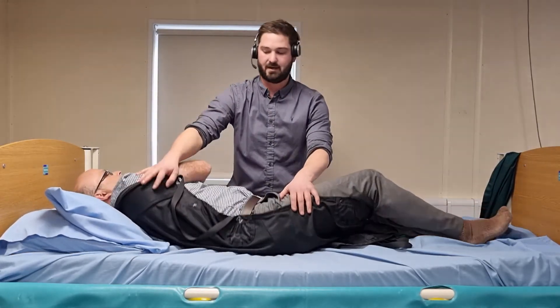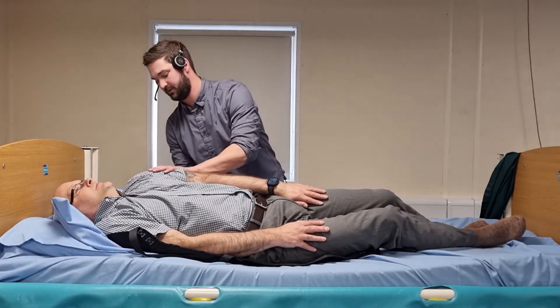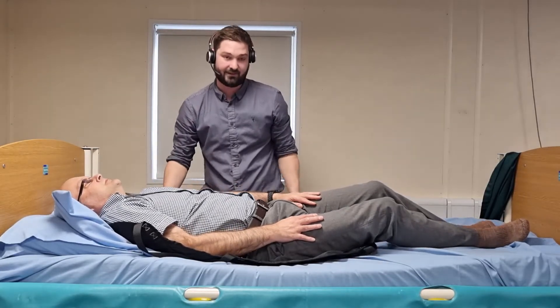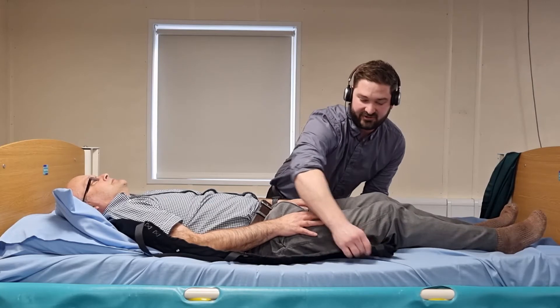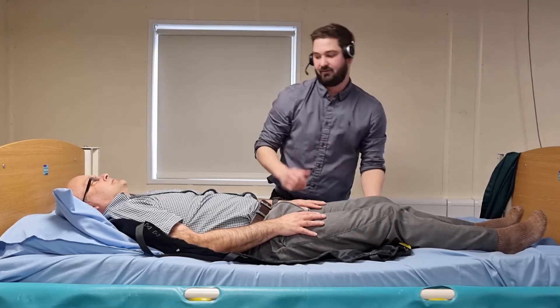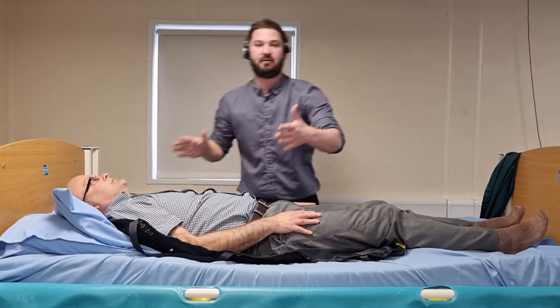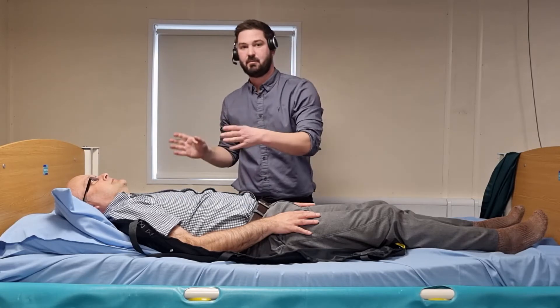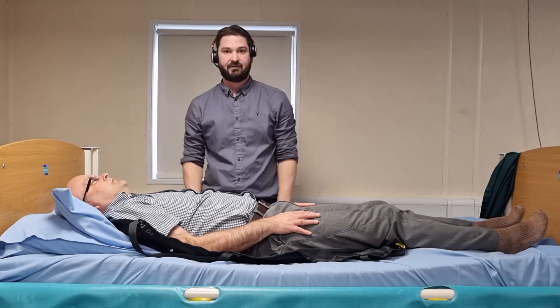Once I'm happy with the fit and I've got enough underneath, I can ask him to lay back on his back. I'm just going to lift one shoulder up — I should have enough underneath him to bring the sling through. Once it's in this position, you then need to do a visual check of the sling to ensure you've got an equal amount of sling either side of your person. If you've got more to one side than the other, you'll need to do additional rolls to refit the sling.